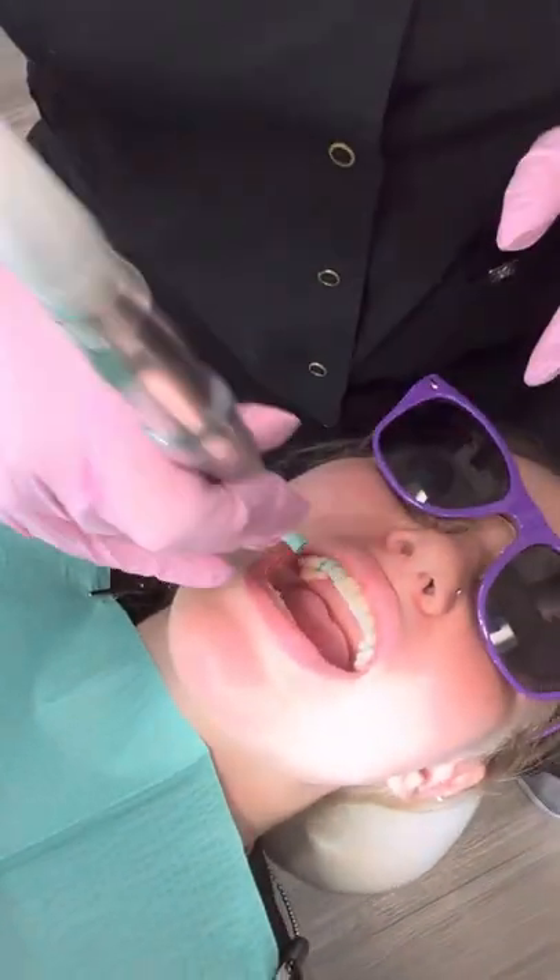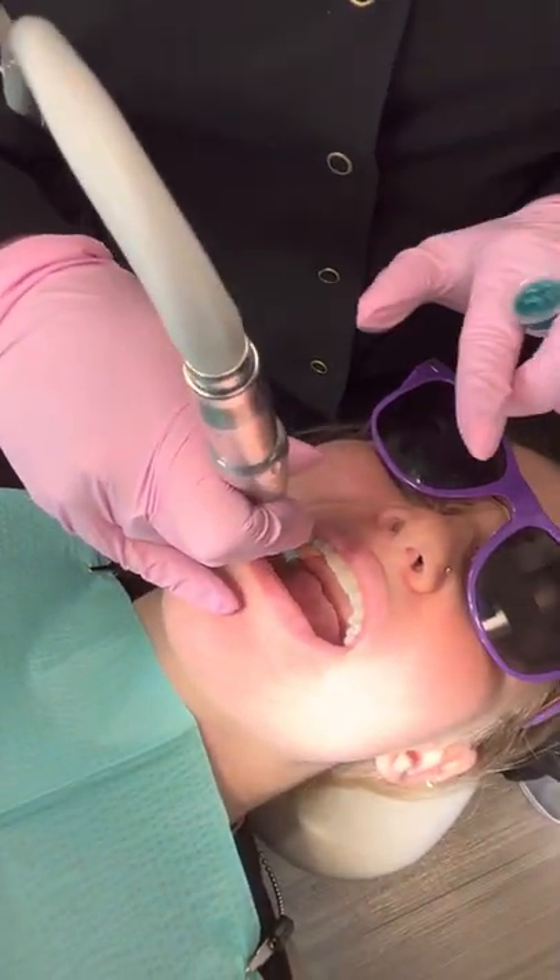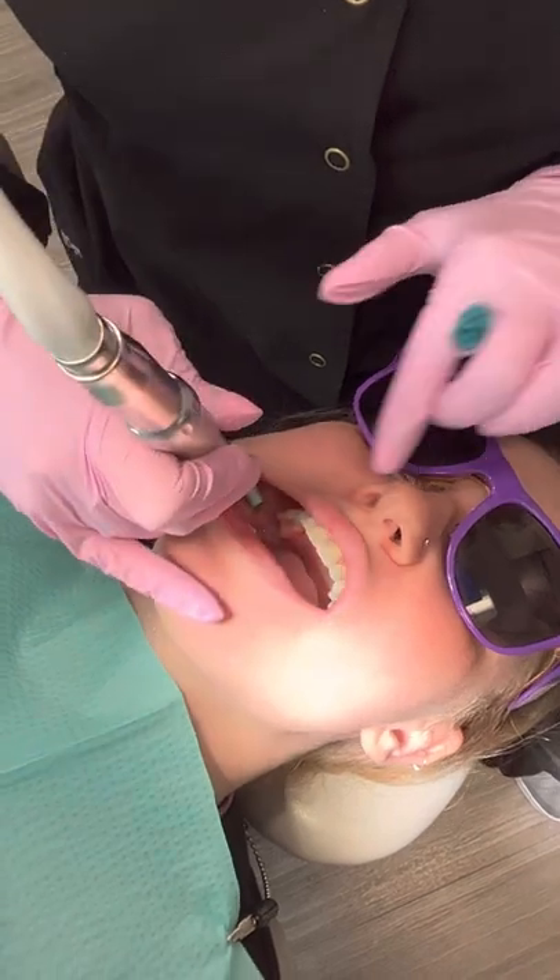Always make sure you're retracting the cheek and never pushing the handpiece like this. Push your handpiece in and retract.